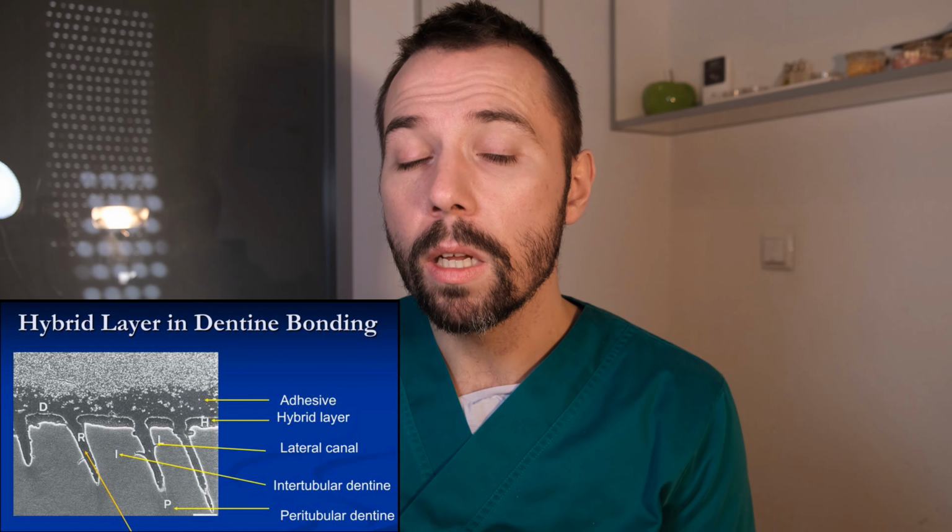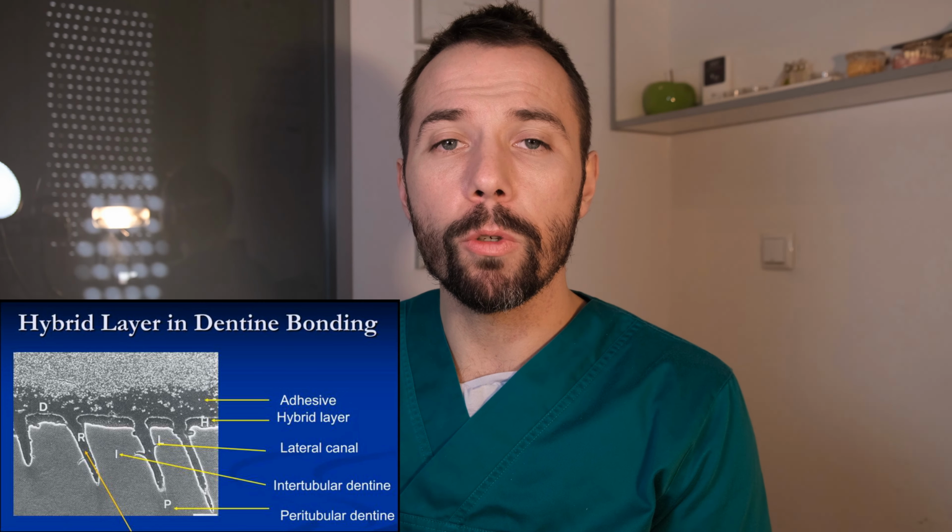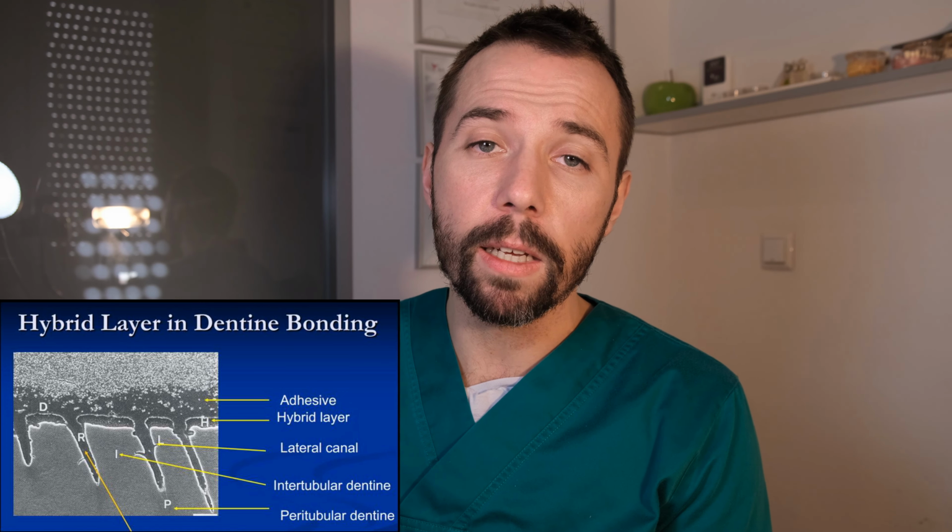They come in a plastic form or in liquid form depending on the type of the composite, and they are chemically connected with the surface of the tooth. You need to treat the tooth before and after you place the composite filling on it. You form it in a plastic way, as you want it, and you polymerize it with a polymerization lamp. It usually lasts 5, 10 or 20 seconds depending on the material itself.